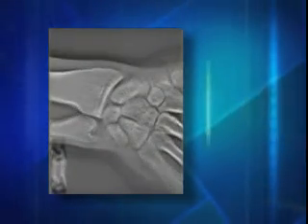Tomosynthesis imaging systems use data acquired in a manner very similar to conventional linear tomography. During the acquisition, the X-ray tube moves in one direction as the detector is moving in the other direction. Unlike linear tomography, the acquired data is reconstructed so that layers at different layer heights are simultaneously reconstructed.